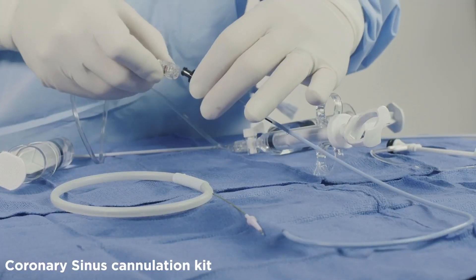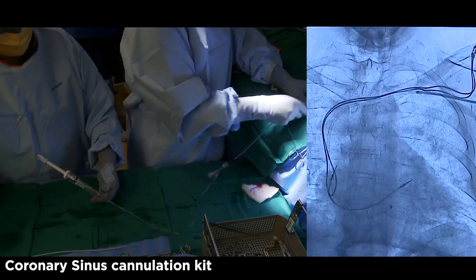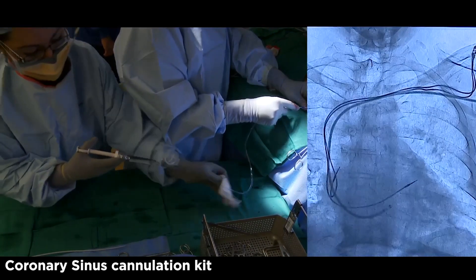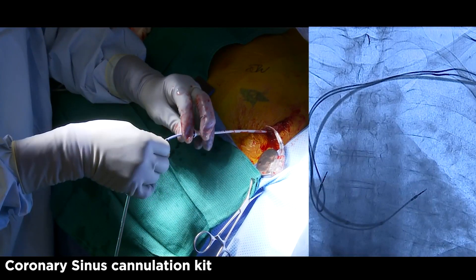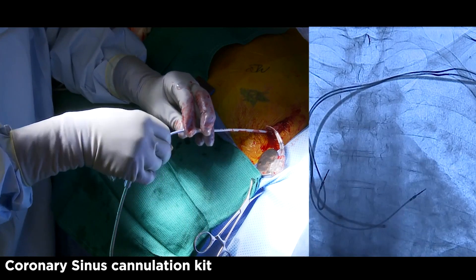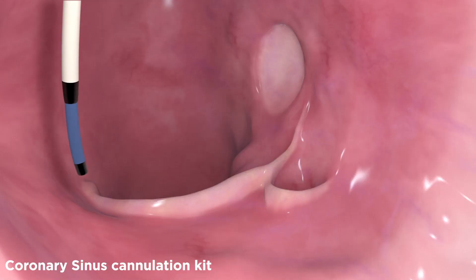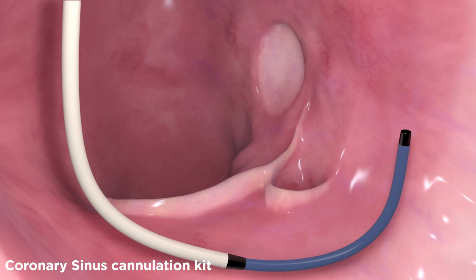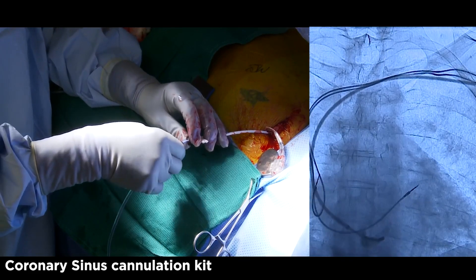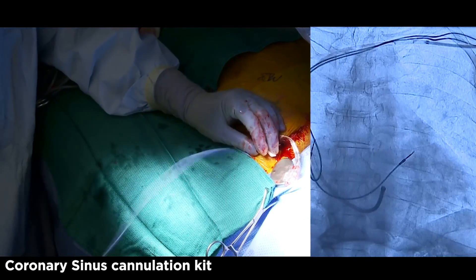Attach the contrast kit to the braided core and insert into the coronary sinus guide sheath. Advance the braided core until the black mark reaches the hub of the sheath. Hold the braided core in place and pull the CSG sheath back until about one finger space between the hub of the CSG and hub of the braided core. Hold the CSG hub in place with one hand while providing counterclockwise torque to the braided core with the other hand. While providing counterclockwise torque, slowly pull back on the sheath and braided core as one unit. This will cause the tip of the braided core to drop down the tricuspid annulus into the pocket created by the eustachian ridge and Thebesian valve. Give a puff of contrast to confirm location within the CS. Advance the braided core gently into the CS followed by the sheath. Remove the braided core and CS cannulation has been accomplished.